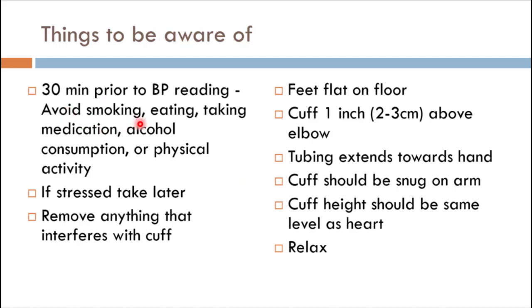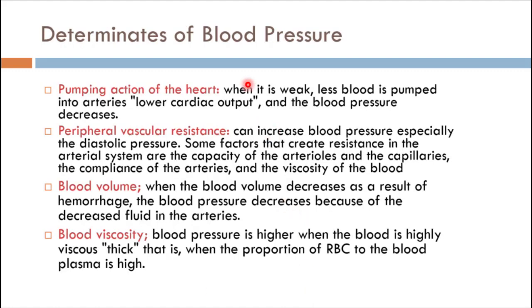You want to avoid any type of stimulants or depressants. Remember, the heart is sensitive to its environment. It's a window to the stress, and that doesn't affect only heart rate, but also the force of contraction. You want to make sure your feet are on the floor, no dangling. These are some of the technical aspects that we'll go over in class, part of the lab procedures. And then the determinants of blood pressure, again, it's a window to stress.